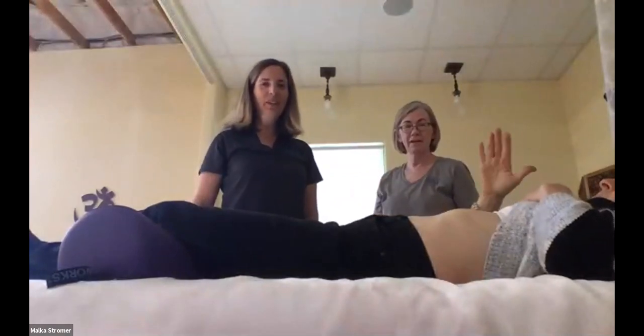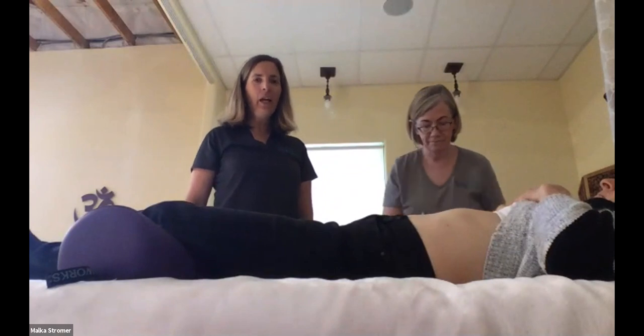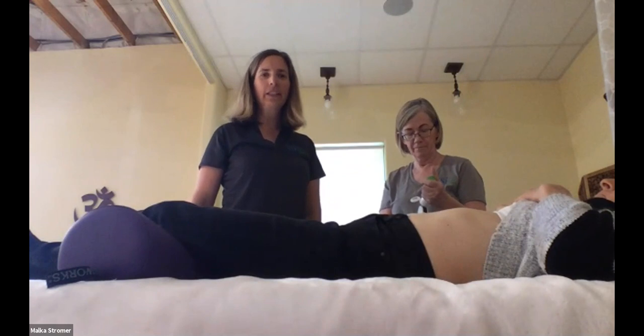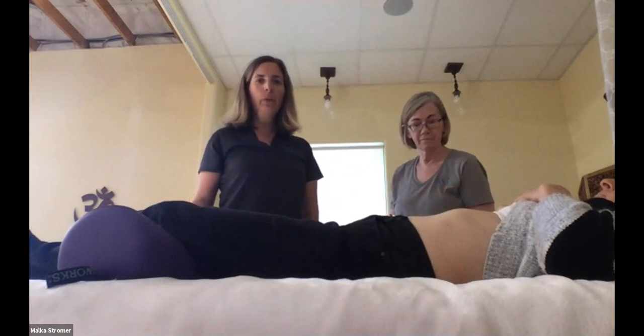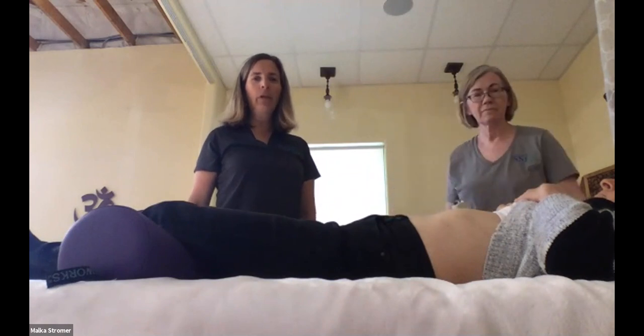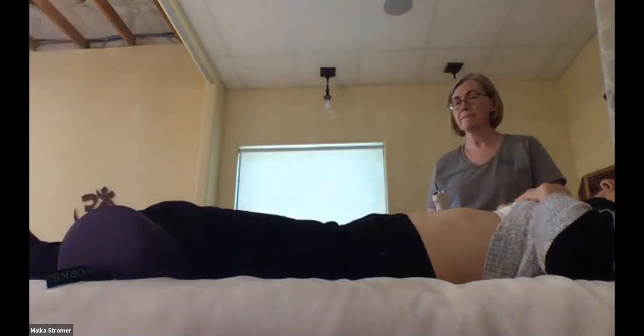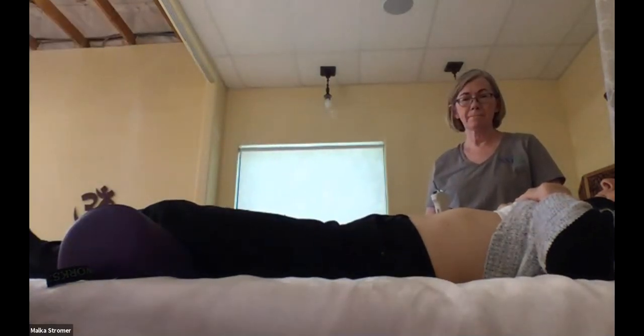It's Malka Stromer and Janine Noble from Sound Sports Imaging. And today we are here at Integrative Medicine for the Soul in Phoenix, Arizona. We are going to be talking about scanning abdominal aortic aneurysms. So first off, we're going to have a little bit of a presentation, and then we'll get started.